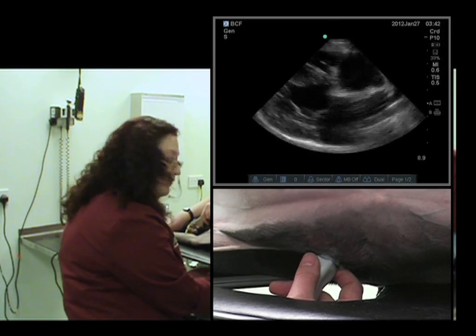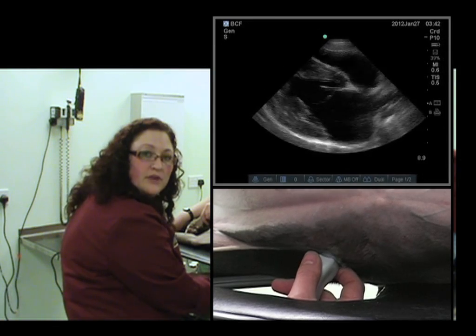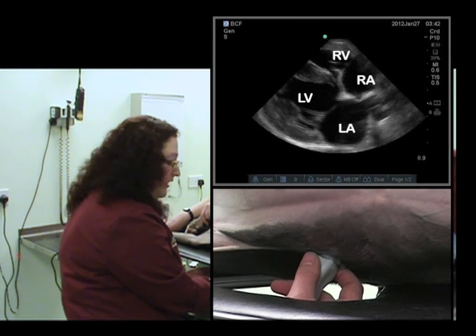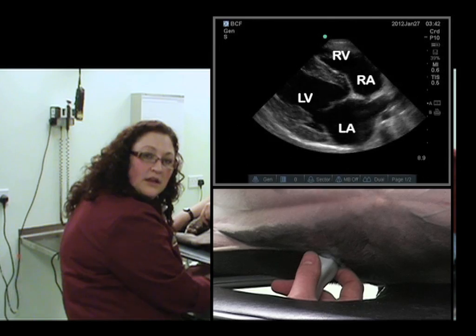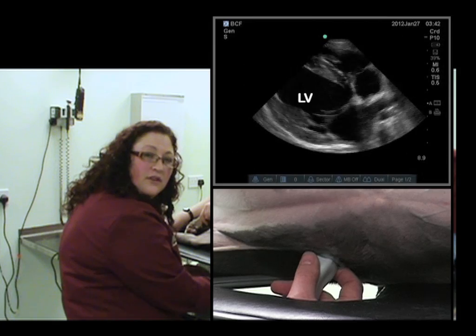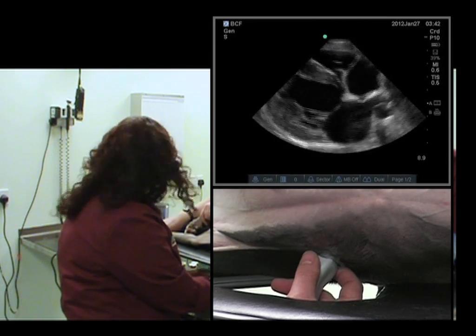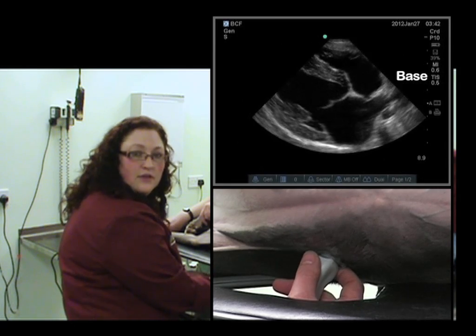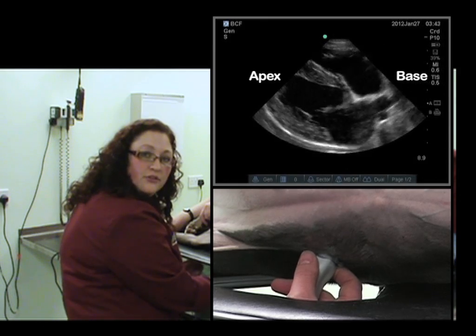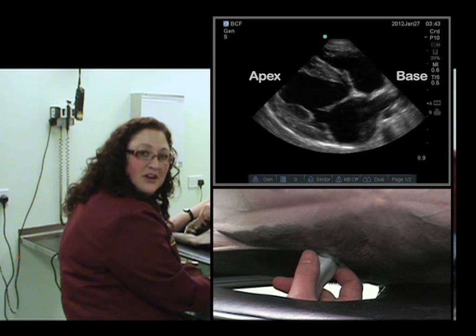What we're looking for in this right parasternal long axis view is the four-chamber view. We'll be looking at the right atrium, the right ventricle, the left atrium, and the left ventricle. We want the left ventricle to be as horizontal as possible so we know it's truly in a long axis view. By convention, the base of the heart is towards the right of the ultrasound image and the apex is towards the left. We'll look at our ultrasound image and see what we need to do to optimize our right parasternal long axis four-chamber view.